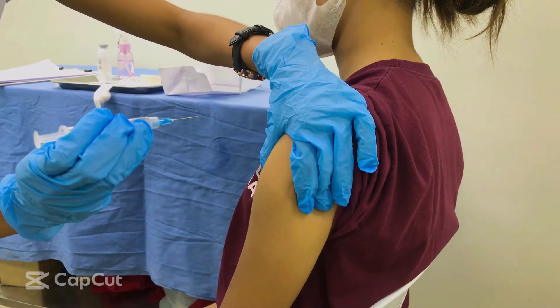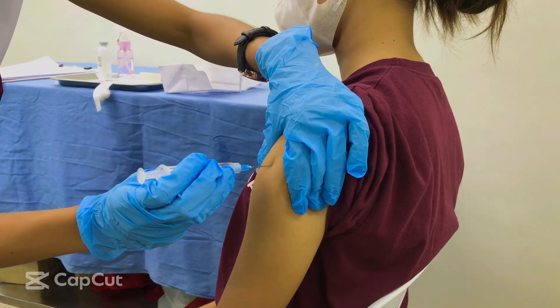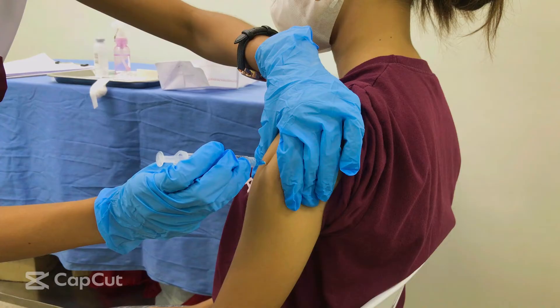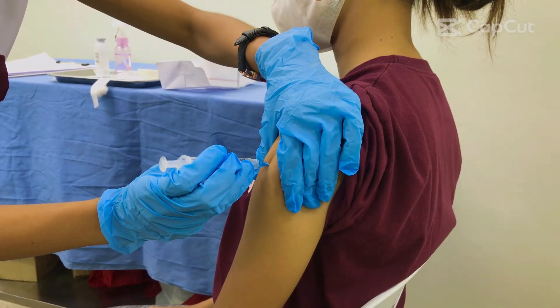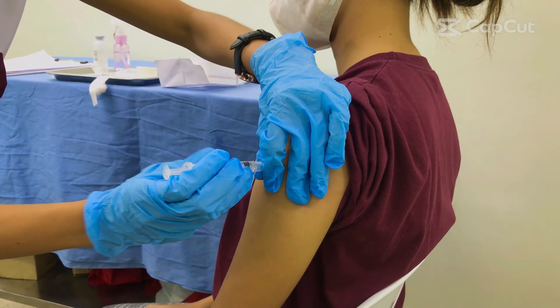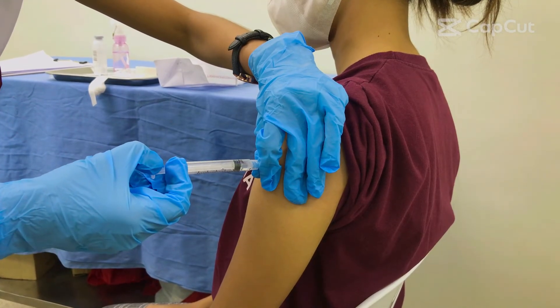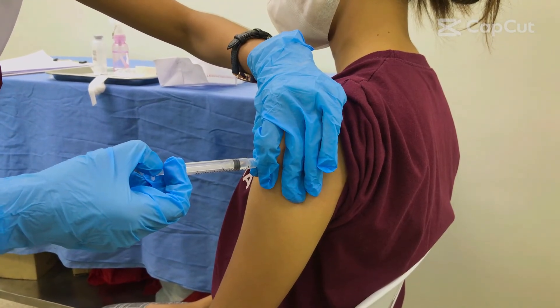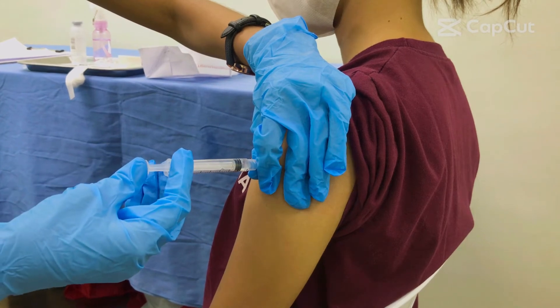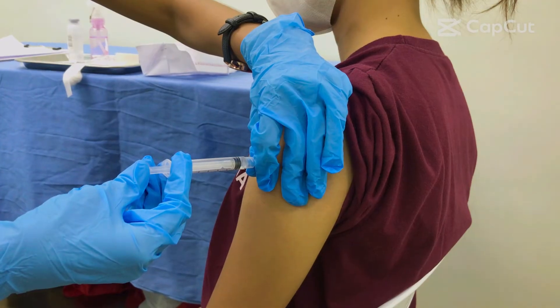With the dominant hand, inject the needle quickly at a 90-degree angle into the muscle using a smooth, steady motion. After the needle pierces the skin, grasp the lower end of the syringe barrel with the non-dominant hand to stabilize. Move the dominant hand to the end of the plunger. Pull back on the plunger for 5 to 10 seconds. If no blood appears, inject the medicine slowly at a rate of 1 ml per 10 seconds.